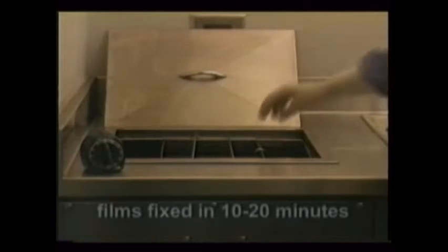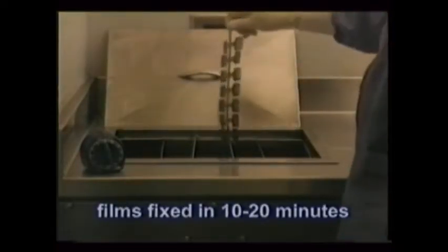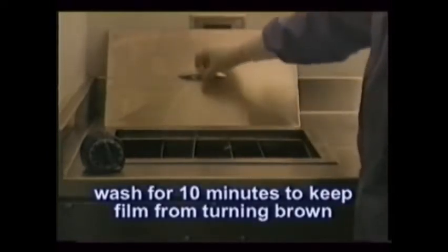Depending on the chemicals, films are completely fixed in 10 to 20 minutes, and then they're washed in water for at least 10 minutes to remove all residual fixer, which could turn the film brown over time if not removed.